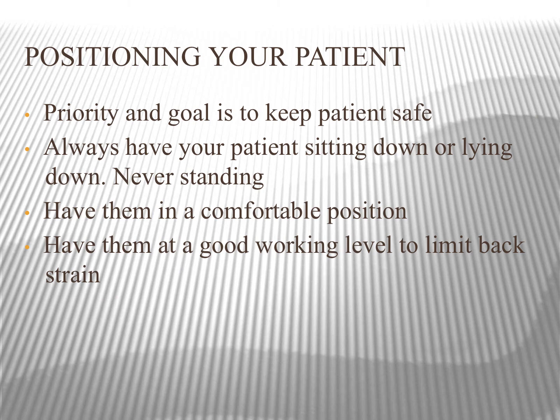Positioning your patient is important. We want them to be comfortable. We also want to be able to access so we can get a good draw. Priority and goal is always to keep our patient safe. Always have your patient sitting down or lying down when you're drawing. Never let somebody stand while you're drawing, even if they insist, because if they do get dizzy or faint and they fall, they're going to injure themselves.